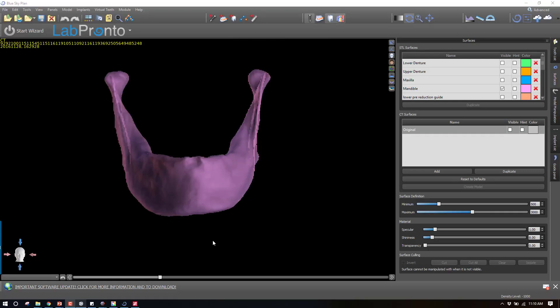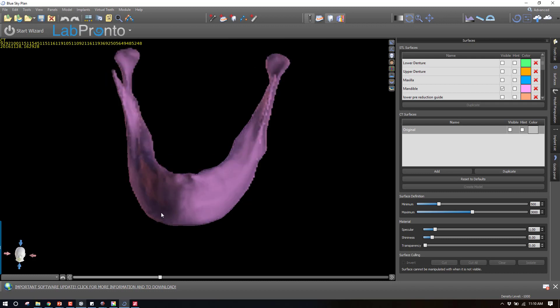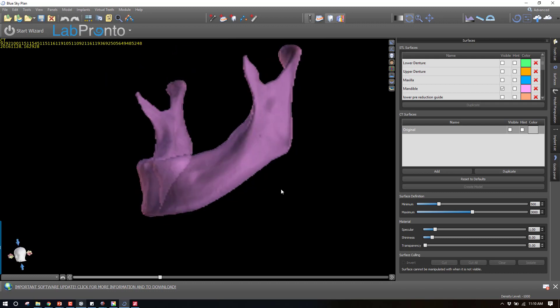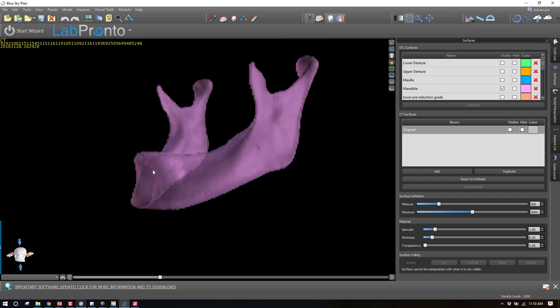Okay, in this video I'm going to show real quickly how you would do a study model that you subtract the nerve out of a mandible. This is going to be using a function called a boolean subtraction, and these make for really nice study models.